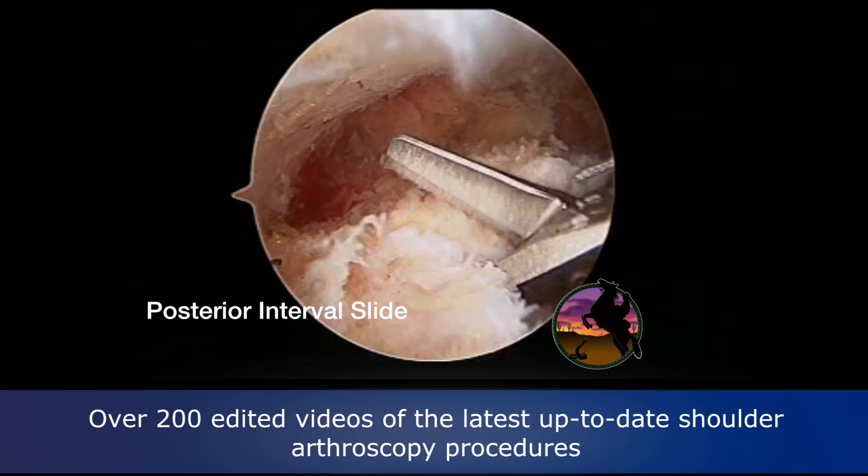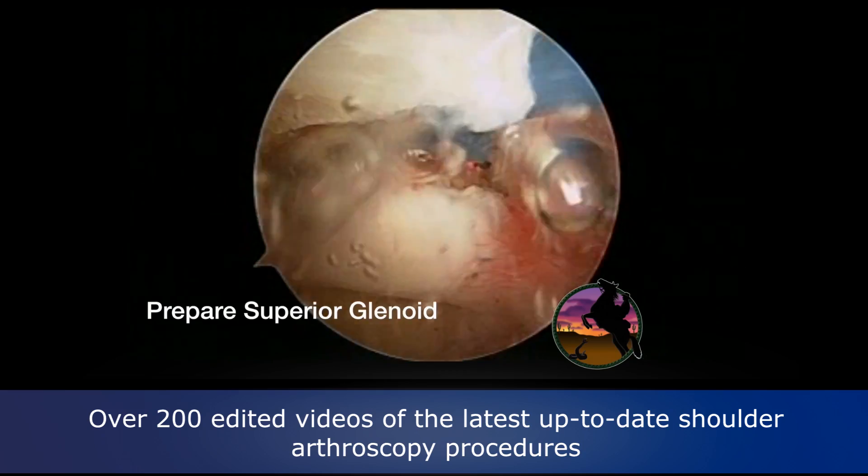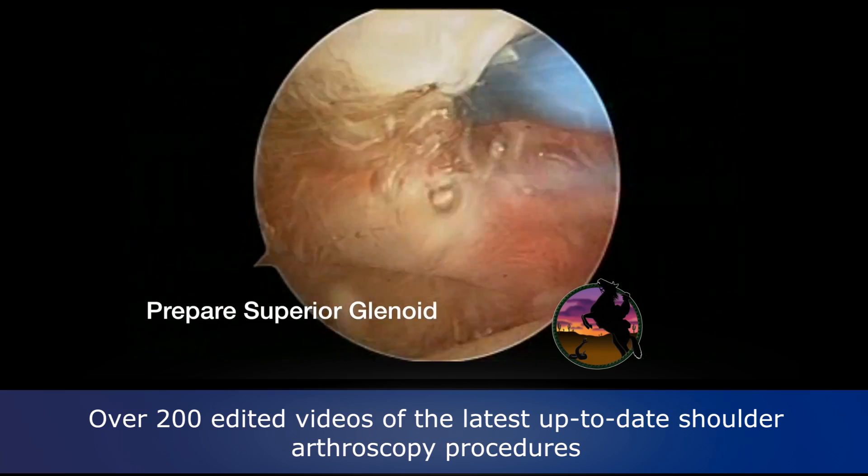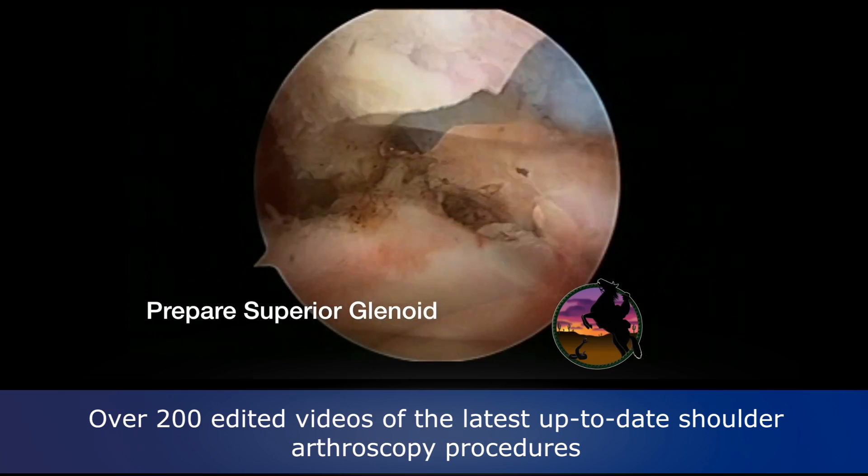We do a posterior slide on this right shoulder just to see if we can get it. This opens up our superior glenoid so that we can prepare it a little more easily, having done the slide.